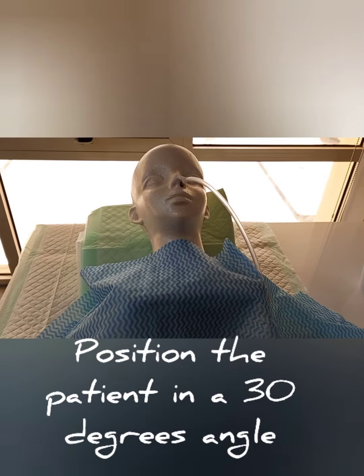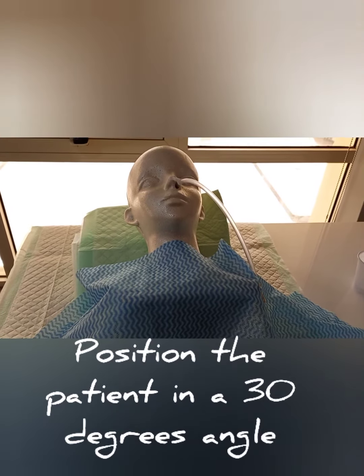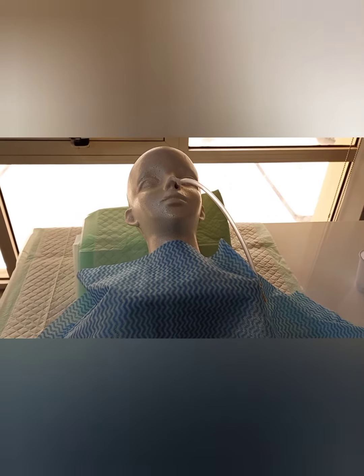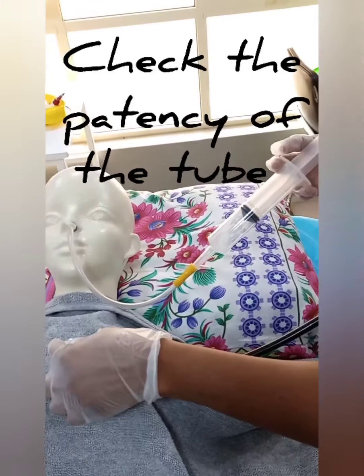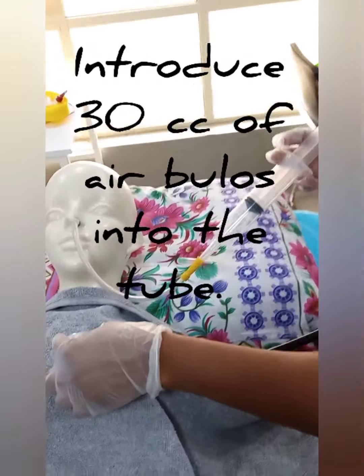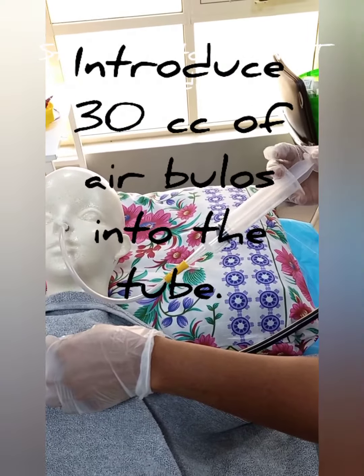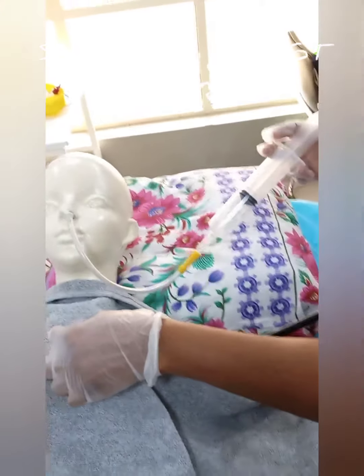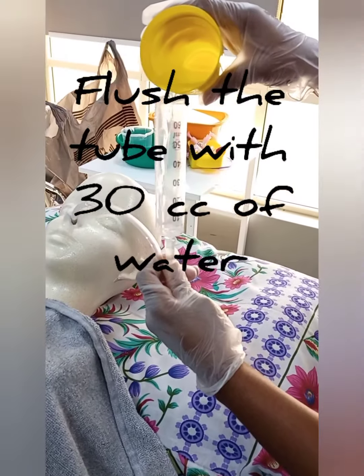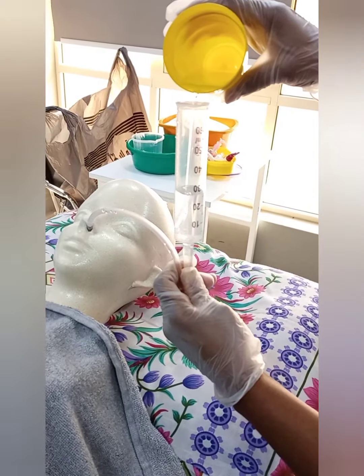Prop the patient or place the patient in 30 degrees angle. Check the patency of the tube. Introduce 30 cc of air bolus into the tube. Use your stethoscope to hear gurgling sounds. Flush the tube with 30 cc of water.